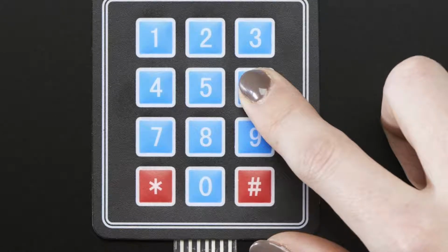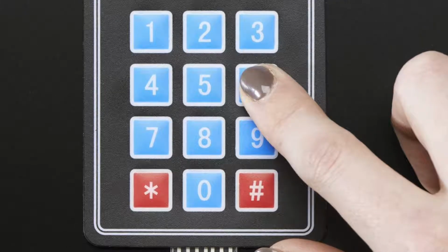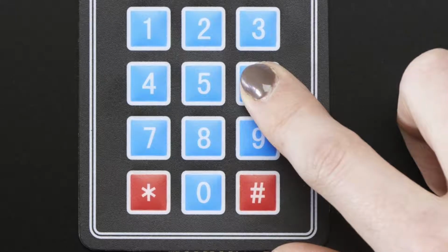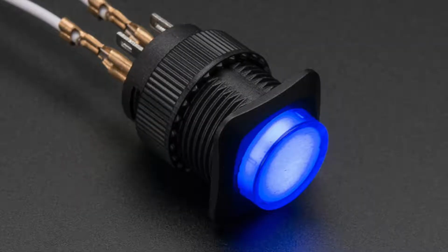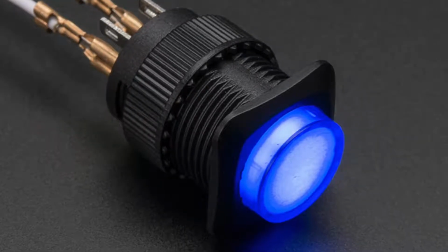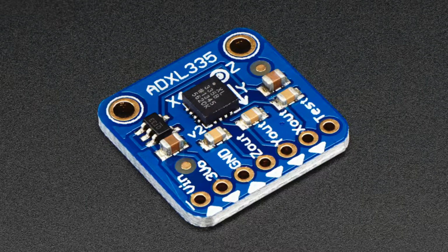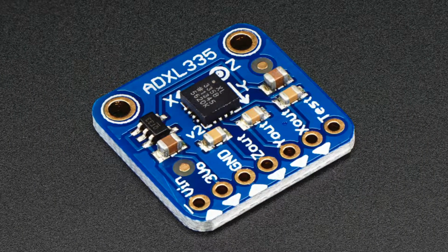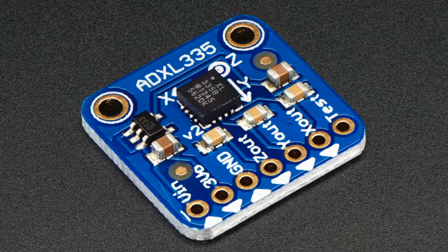The number keypad allows the MERT response person to select what type of test he or she would like to conduct on the subject. It additionally allows the subject to input their PIN ID into the keypad as part of Test 3. The LED push button allows the user to obtain the average reaction time for Test 1 and Test 2 respectively. The accelerometer is a motion sensor that detects the changes in position, used for Test 4 and Test 5 to determine if the subject is unable to reach stability.